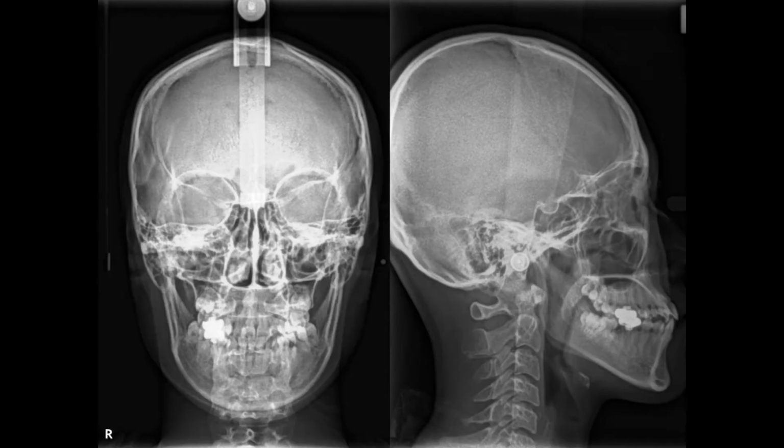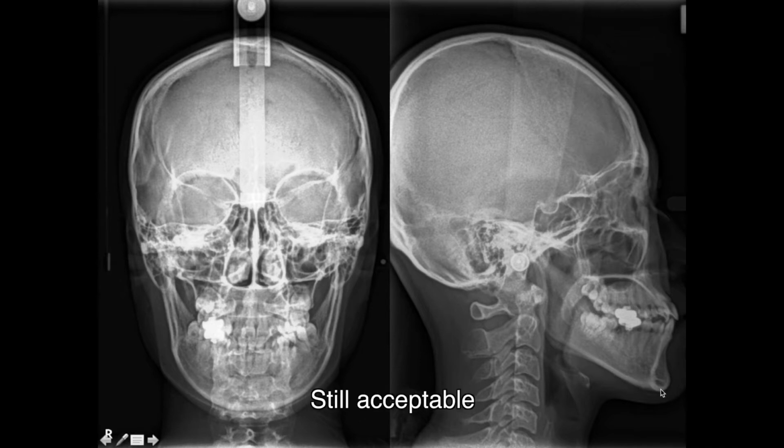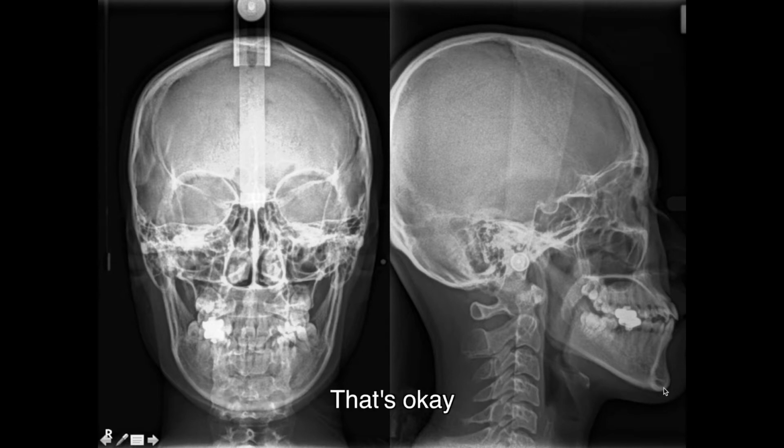Okay, next. Now this is X-ray of your face. You can see your lower jaw is slightly larger, only slightly, still acceptable. You have a very steep mandibular plane angle. That's okay. Overall, it looks good.